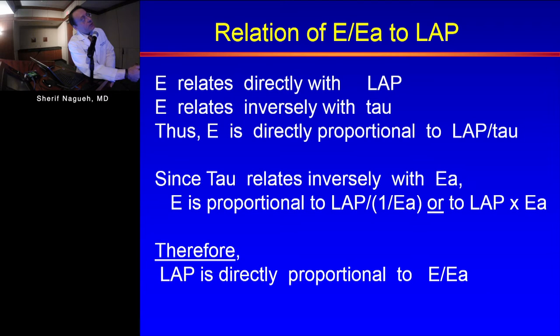The mitral E velocity relates directly with the left atrial pressure. The mitral E velocity relates inversely with the time constant of LV relaxation.